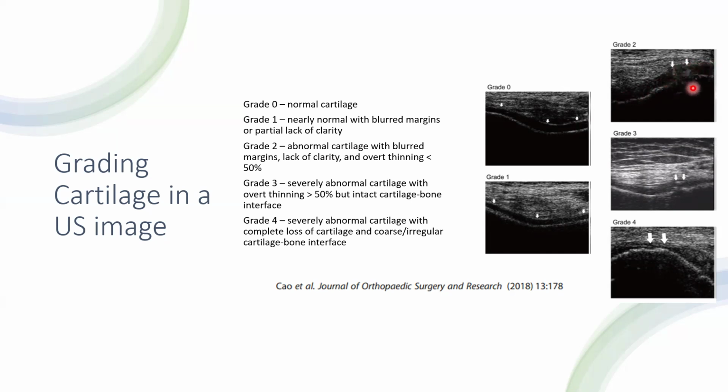You'll notice here there's some kind of obvious defect on one spot. I don't know exactly what this is, but you can tell it's not normal. And then if you measure these thicknesses, they're probably in the ballpark of half of what they should be. So instead of being 2 millimeters, maybe this is 1.1, 1.2 millimeters, something like that. It's definitely thinner than it should be, and you're starting to see all the other changes as well.